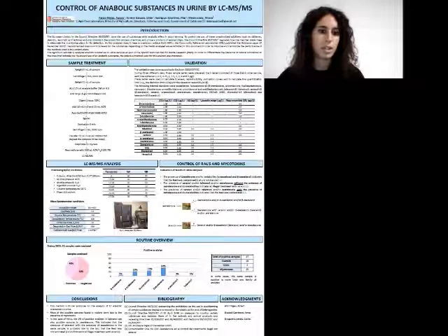Beta-zearalenol is found in 26% of the samples as a consequence of the ingestion of mycotoxins. And to finish, this table represents positive samples by families. 15 samples out of 37 are positive in steroids, 2 in RALs, and 29 are positive in mycotoxins. In some cases, the same sample is positive in more than 1 family of analytes.